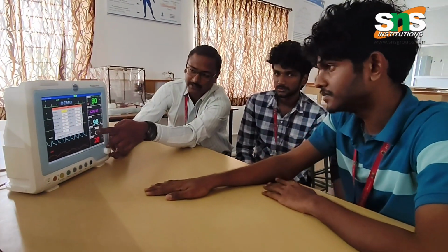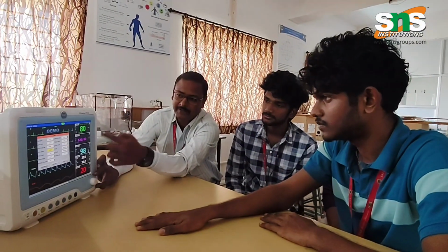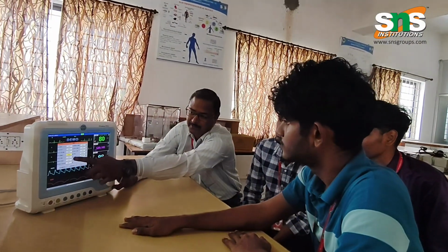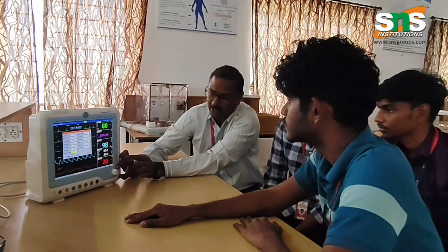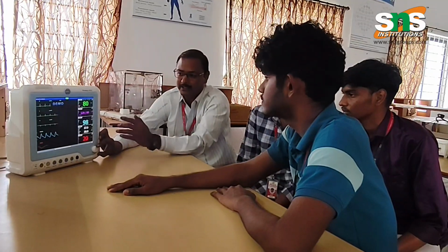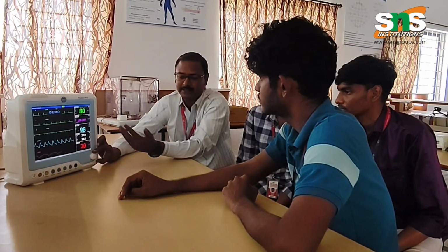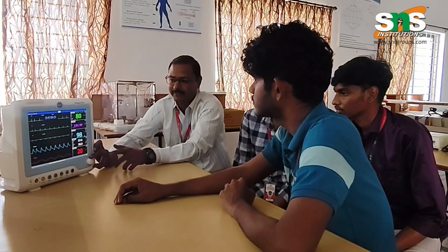If you want to set an alarm on this patient monitoring system for when it has to indicate a high or low level, you can see it is highlighted in yellow. When it goes beyond 160 or below 90, we have set the alarm. It will automatically sound an alarm and alert the nursing staff nearby that the patient has a high BP or a low BP, called hypertension or low BP level. So it is very dangerous, and it is important to monitor it 24/7.